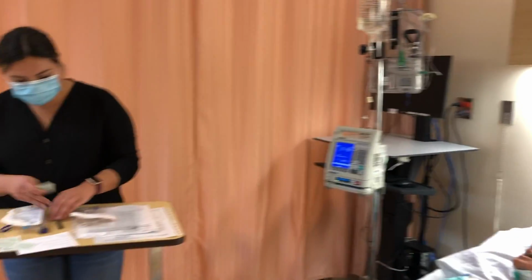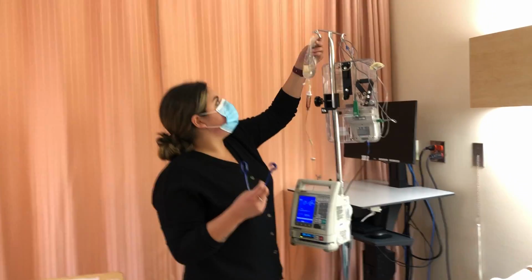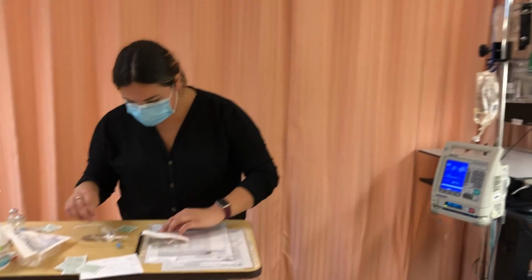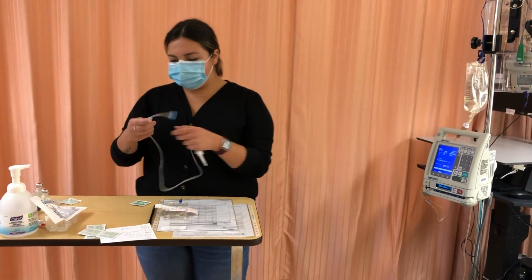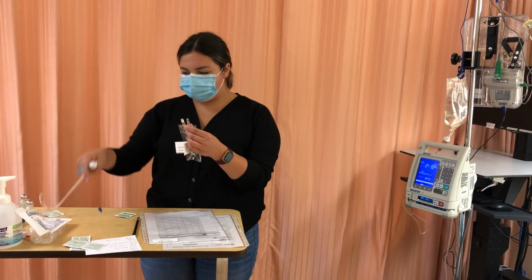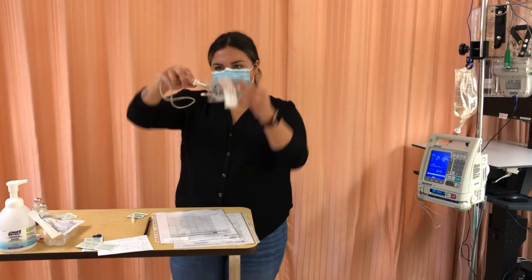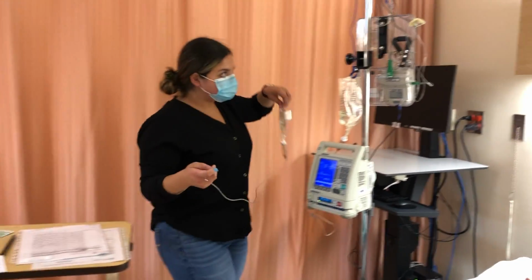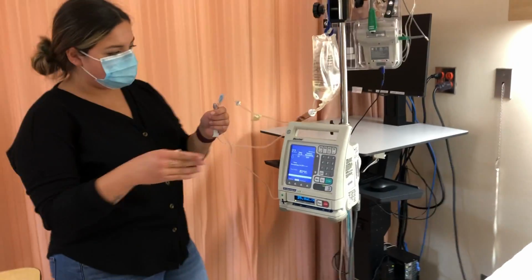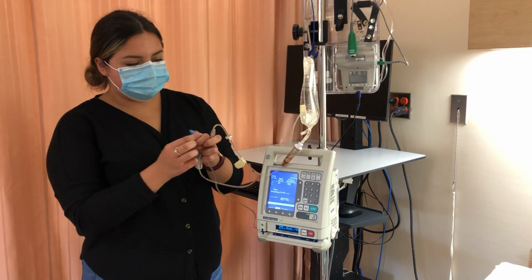So I'm going to prep my mini bag. We have the secondary set here. The blue hook is used to hang the primary line lower than my secondary. So that's hung. And using sterile technique, I'm going to spike my mini bag. Okay. I'm going to hang this up. And using an alcohol swab, I'm going to clean the port above the pump for 30 seconds. Allow that to dry.